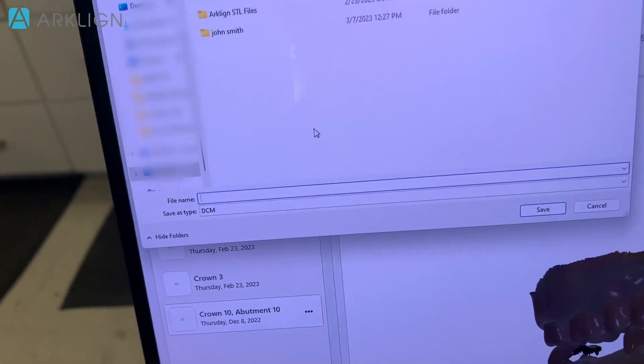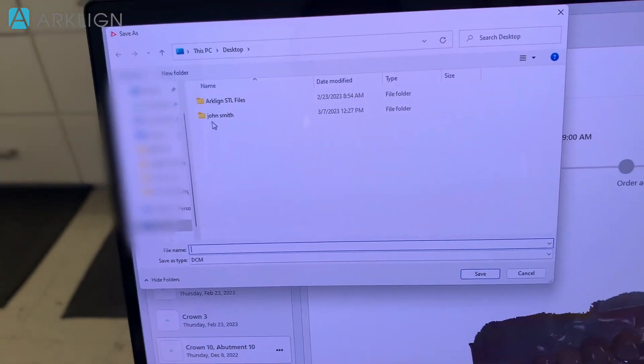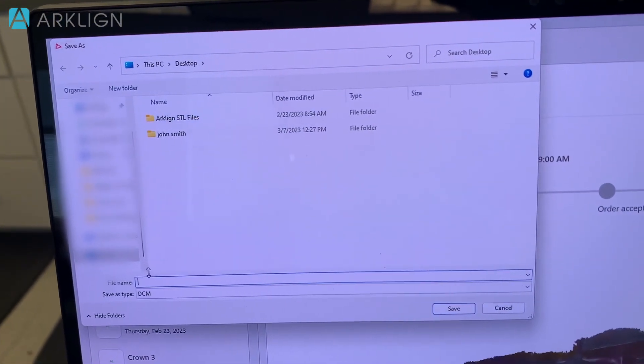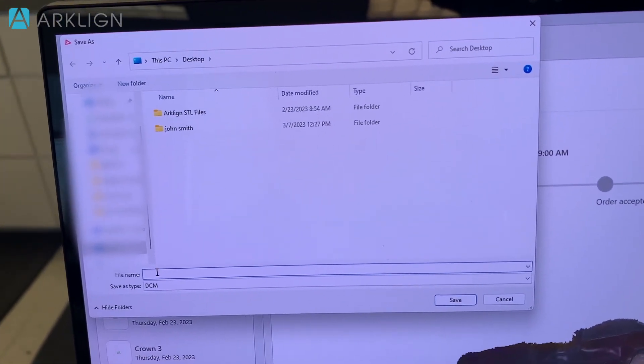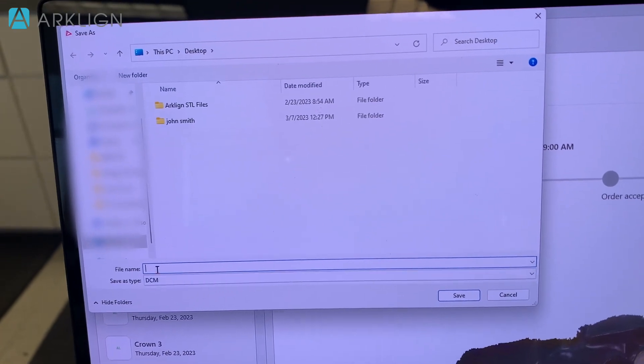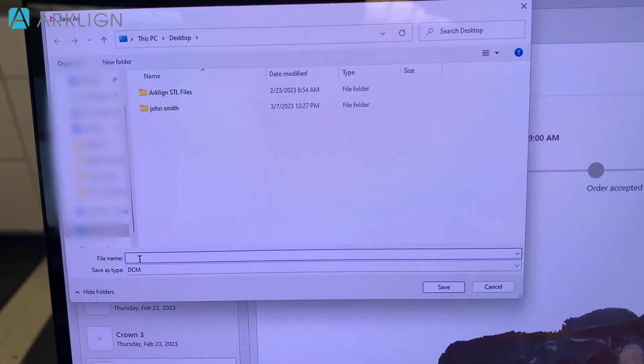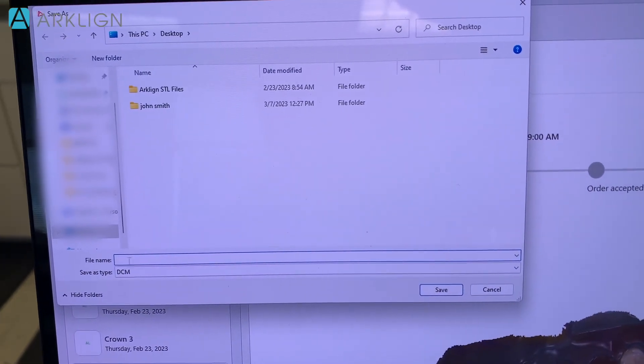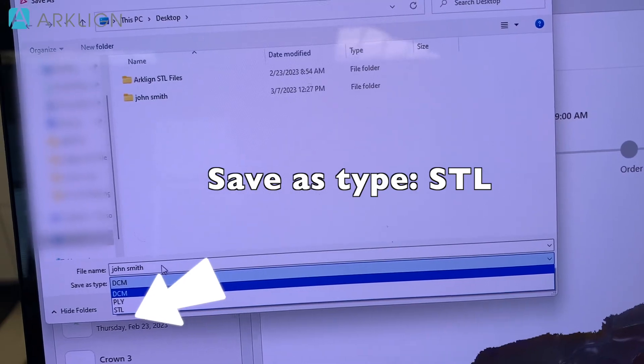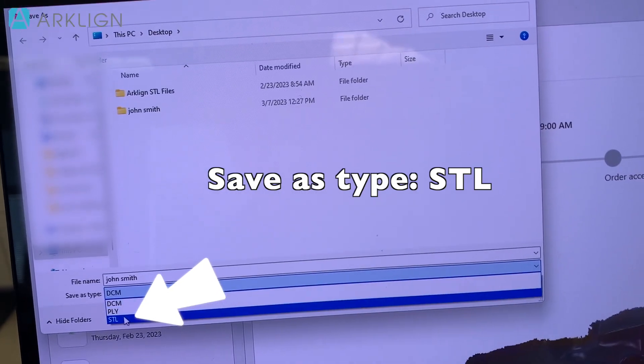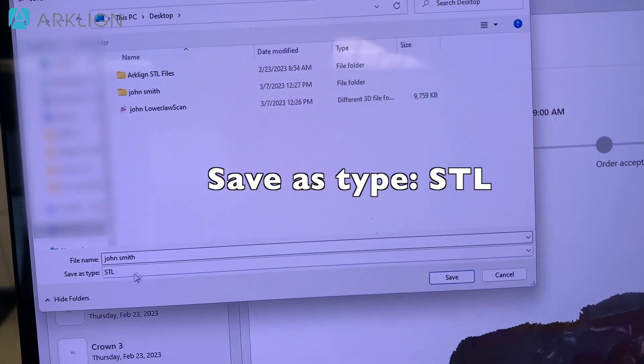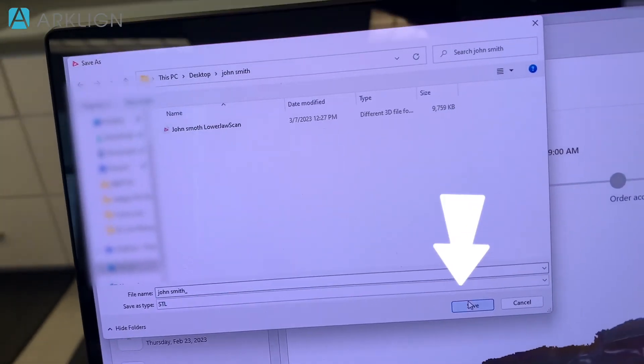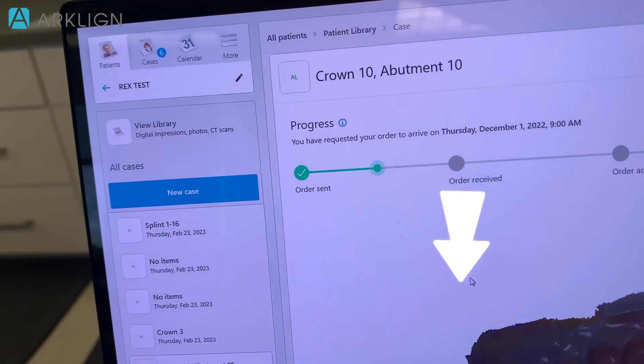Now I create a folder to store all my files and then I will rename it to, let's say, John Smith STL. Click save.